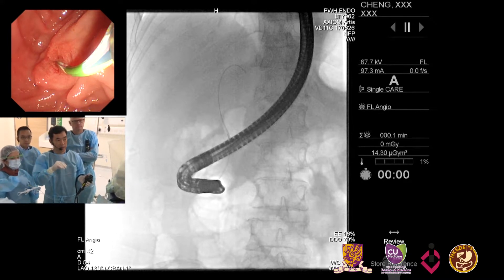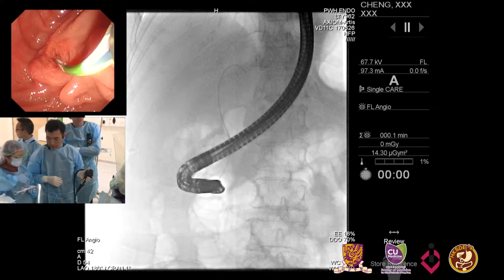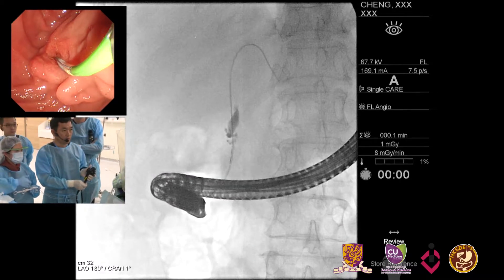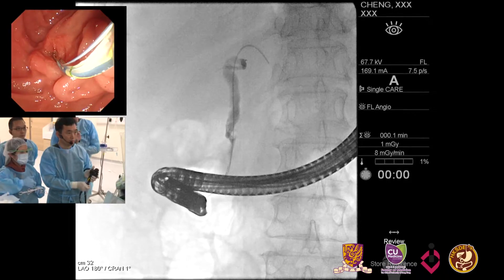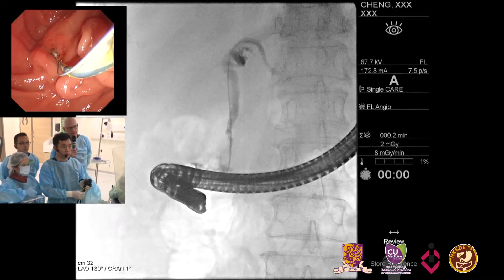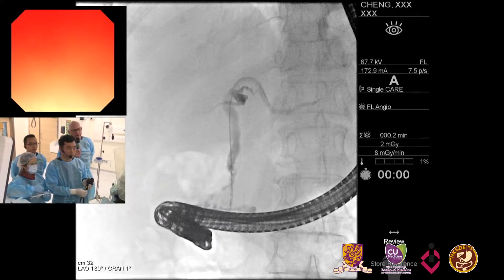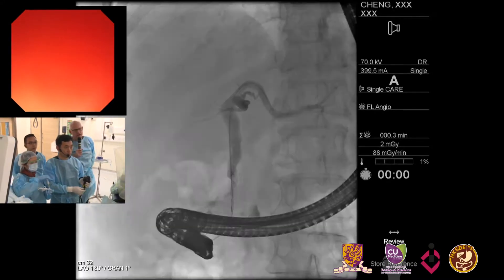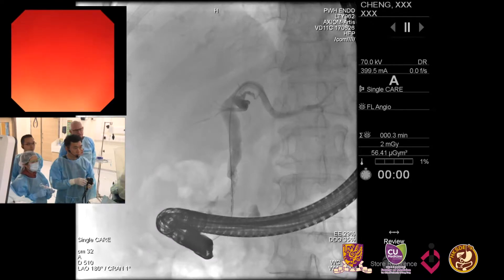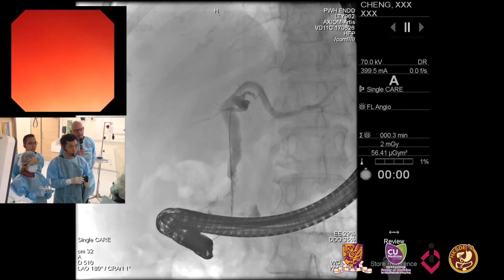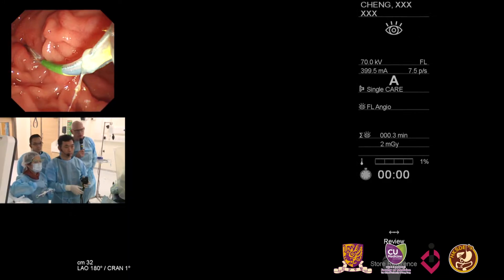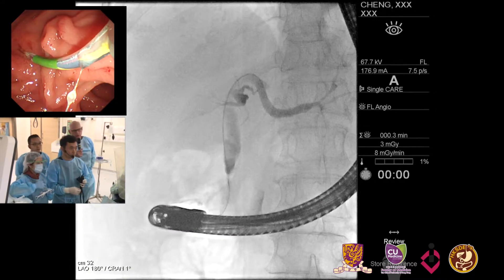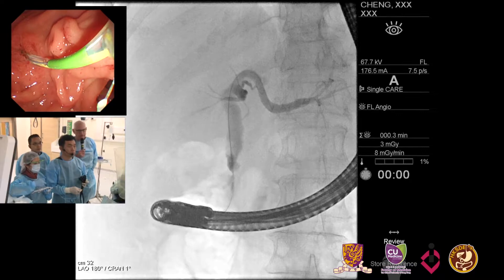I haven't seen the cholangiogram yet, so let's do the cholangiogram. Could you magnify the image? Inject contrast. The patient is off steroids now — she's responded well, the pancreas has shrunk, and clinically she's doing well. It's just this persistent fibrotic stricture. We heard yesterday that to prevent relapse these patients should be on long-term very low-dose steroids, but the decision has been made to stop the steroids in this case.